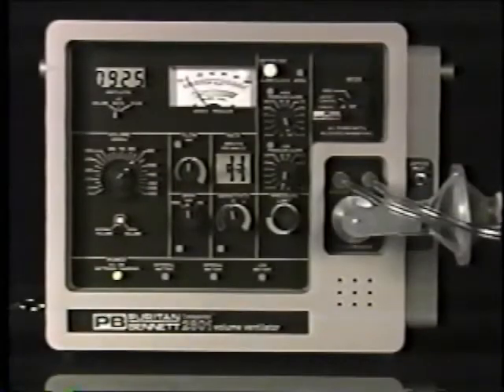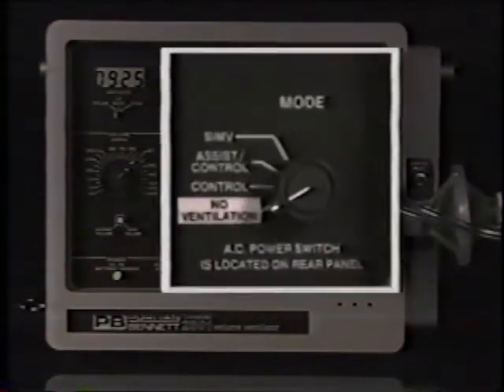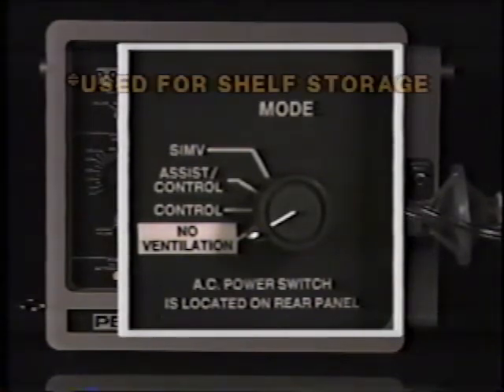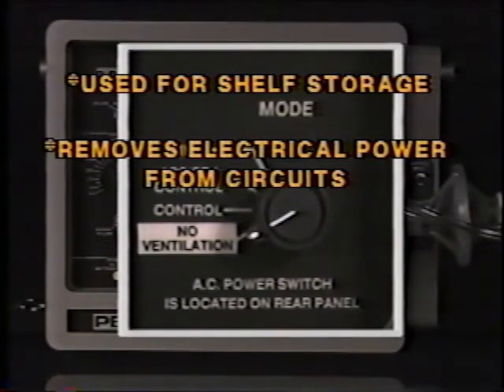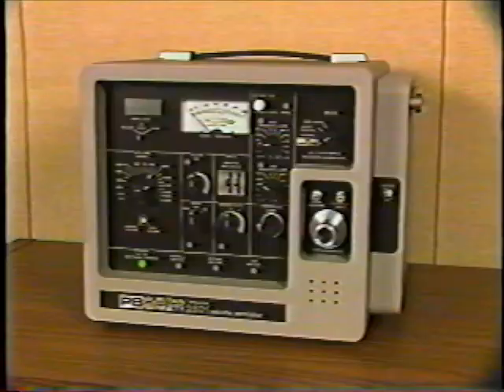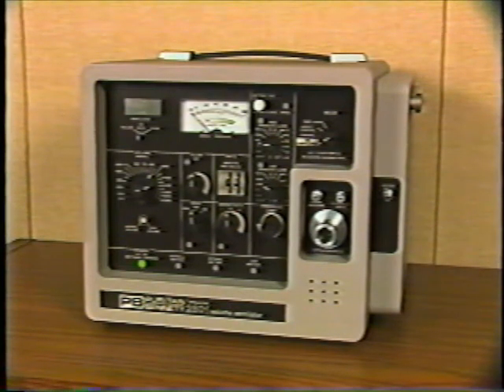The mode switch, located in the upper right-hand corner, is the starting point. The first position, no ventilation, is used for shelf storage. This mode removes electrical power from the internal circuits of the ventilator. In this position, as well as all three modes of operation, the internal batteries and external battery, if connected, will be charged as long as the ventilator front panel AC power indicator is on. The ventilator must be plugged in whenever stored, and the AC indicator must be on in order for the internal and external battery to charge.